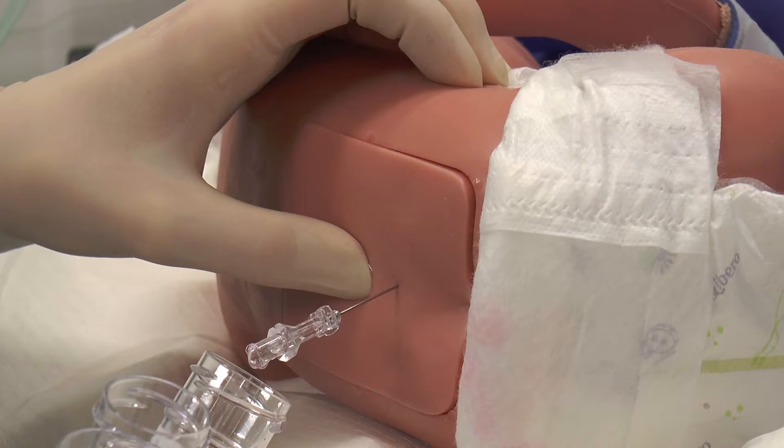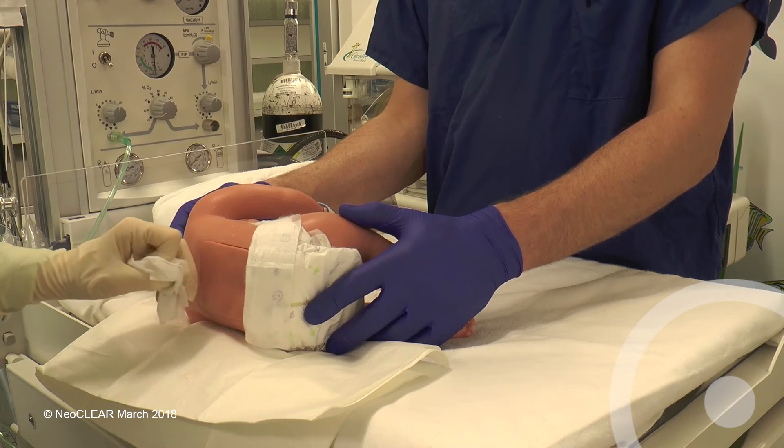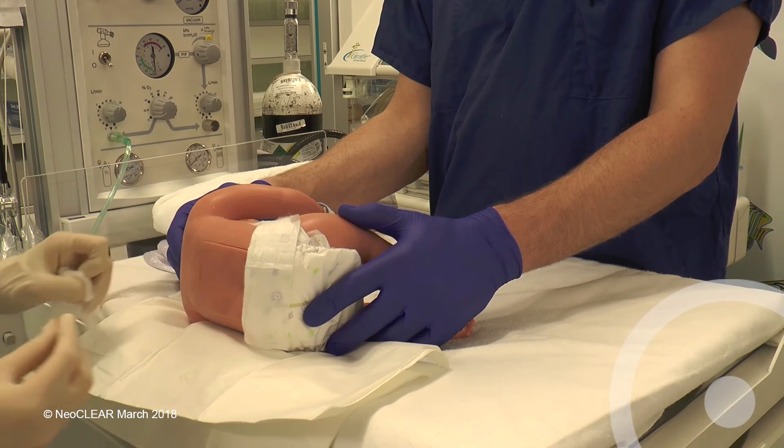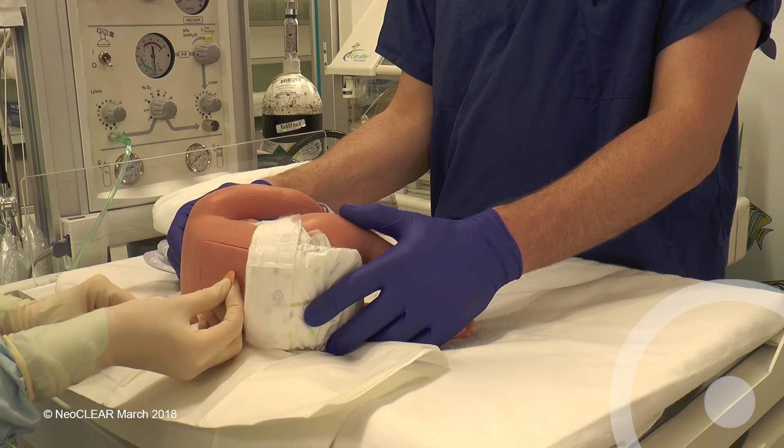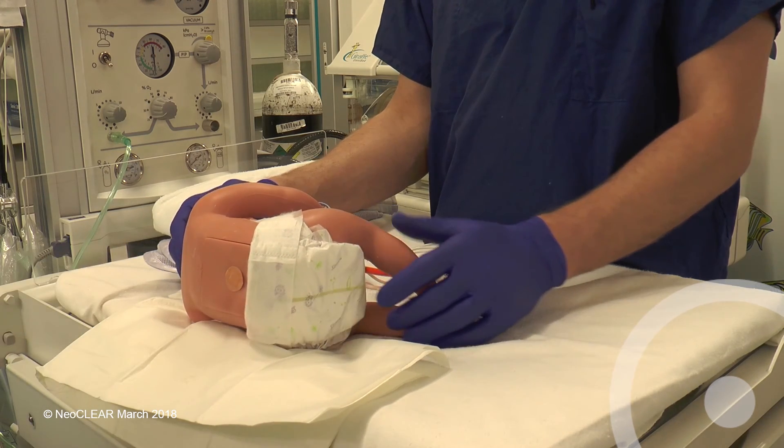Aim to collect into each sterile pot five drops in a preterm baby and eight drops in a term baby. Note the time of the end of the procedure once the needle is withdrawn, if the first attempt has been successful, or continue timing until the end of the second attempt if required. Ensure no CSF or blood is leaking and apply a spot plaster or spray on dressing. After disposing of sharps and clinical waste, complete the case report form and update the parents.